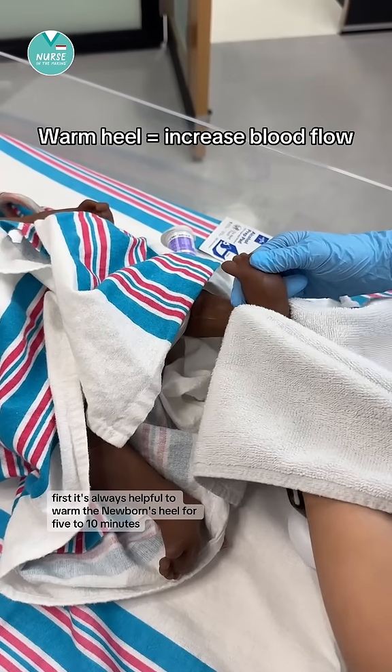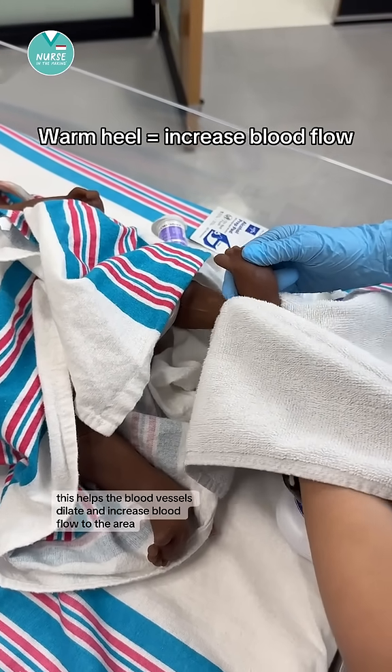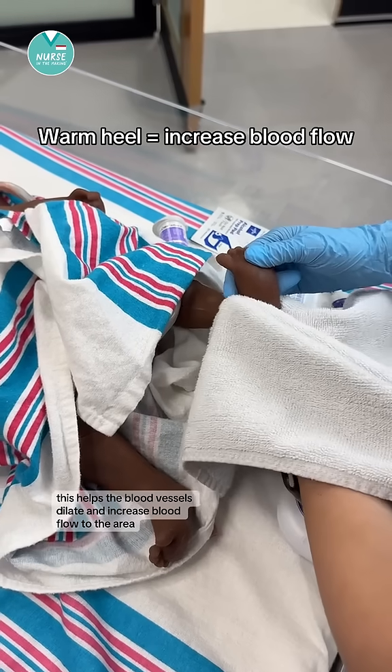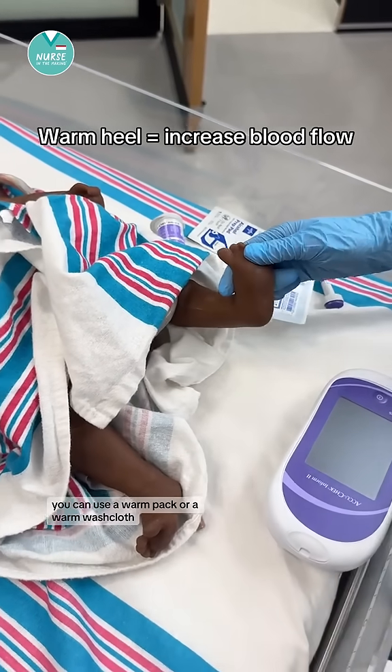First, it's always helpful to warm the newborn's heel for five to ten minutes. This helps the blood vessels dilate and increase blood flow to the area. You can use a warm pack or a warm washcloth.